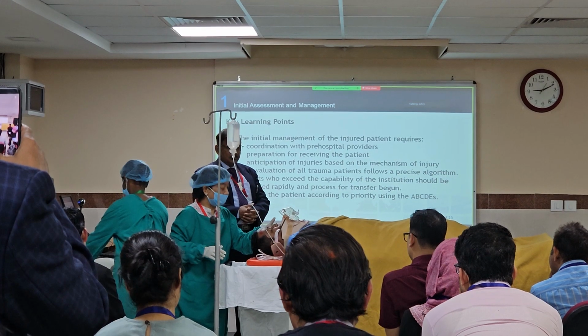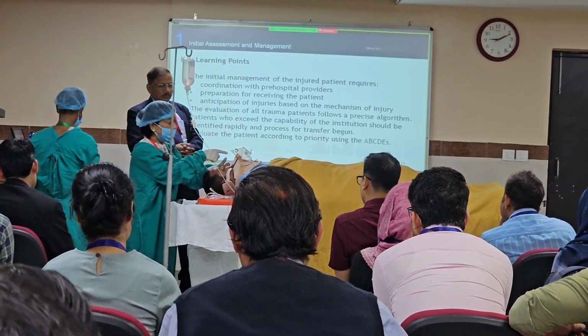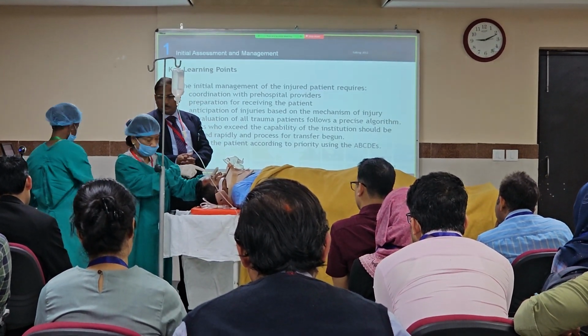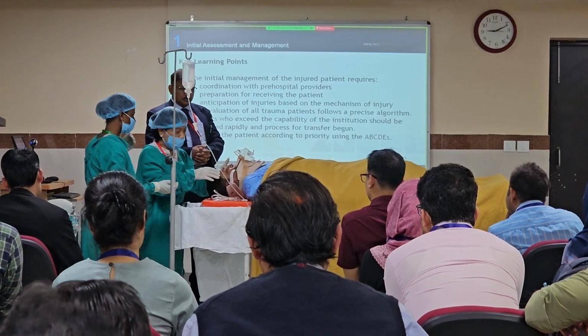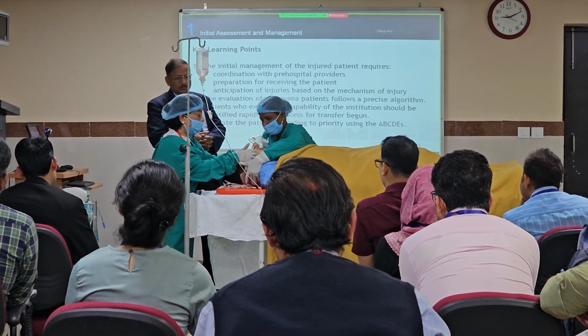And I think I need to secure an airway for him. And before that, you take the instruments here. I'm going to open the collar. Can you please stabilize the neck? Yes. Please do stabilize the neck. Right? So, right. Sir, I've got my laryngoscope.